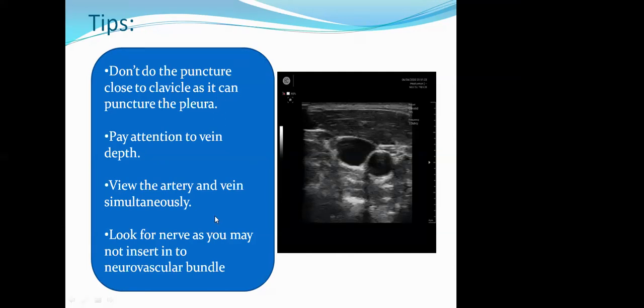While performing the procedure, always look at the artery and the vein simultaneously, and also be careful not to insert into the neurovascular bundle. So this is all about ultrasound-guided central venous catheterization. Thank you so much.